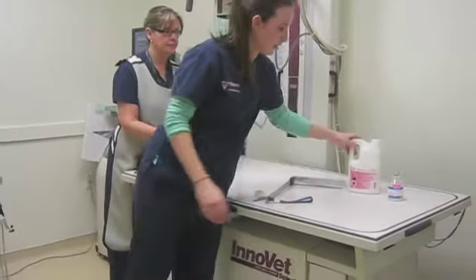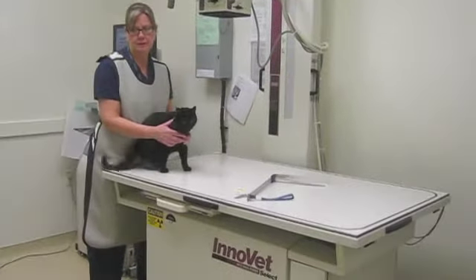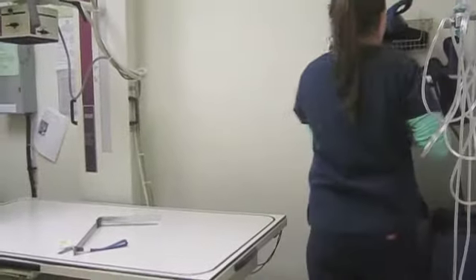The most commonly used agents for GI contrast studies include barium liquid and paste and iodine, as shown here. This is my cat Jackie, a female cat for our GI contrast study.